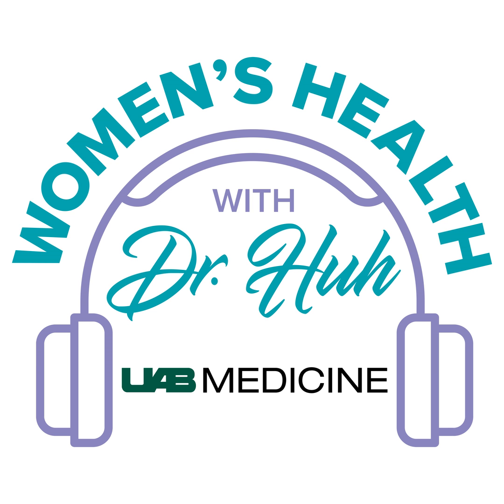The surgeon actually sits at a console adjacent to the patient and manipulates those instruments using the robotic surgical console. The irony of the name robotics is this instrument isn't actually a robot. It does nothing on its own. Everything that it does is controlled and managed by the surgeon.